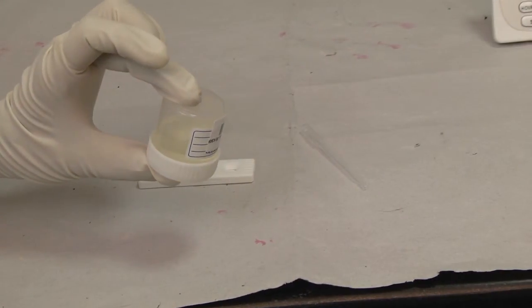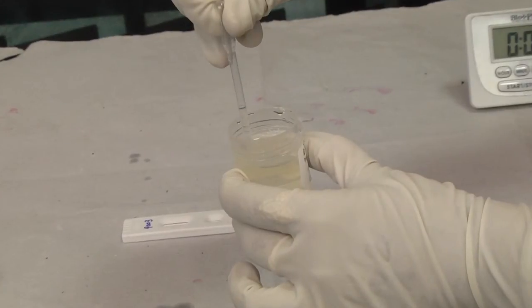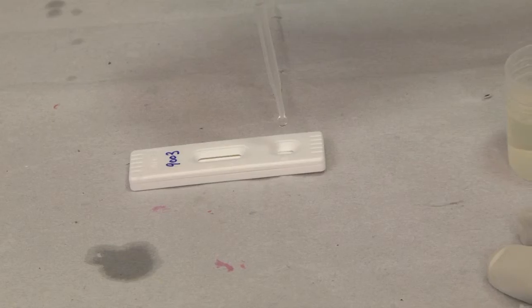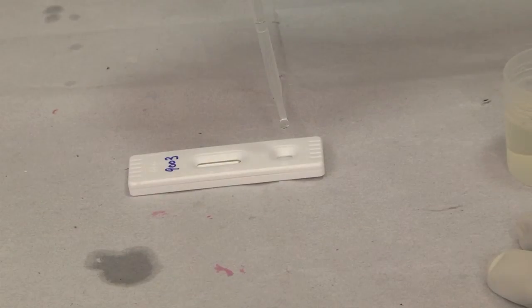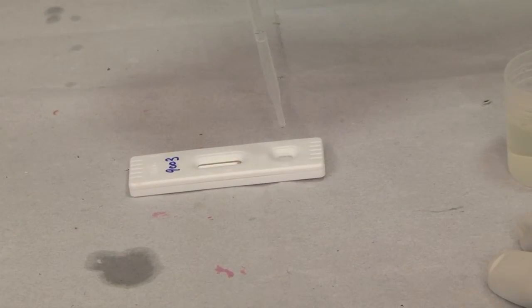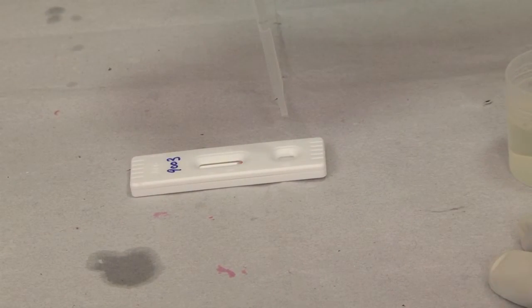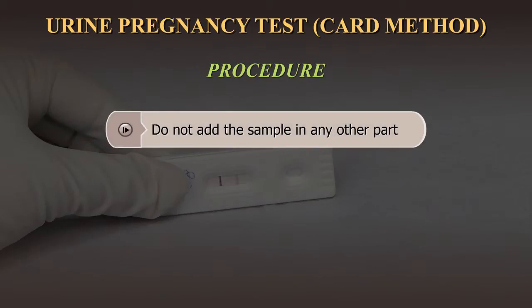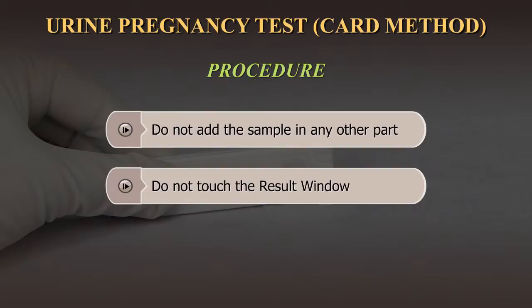Mix the urine sample by inversion and collect it with the dropper provided. Add exactly the number of full drops recommended by the manufacturer into the sample window. Do not add the urine sample in the result window marked C and T or any other part of the test device. Do not touch the result window of the test device.